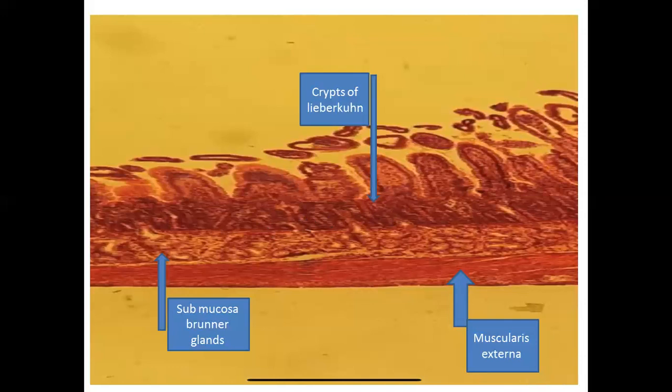اللاب السابق ذكرنا the main cells that constitute the gastric glands اللي هي كانت عددها 6.